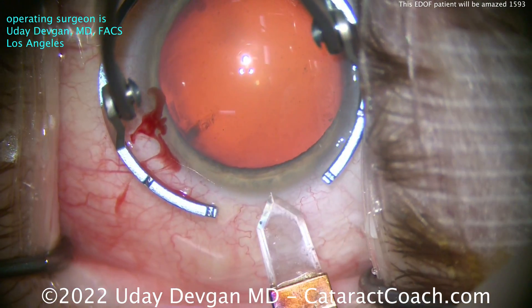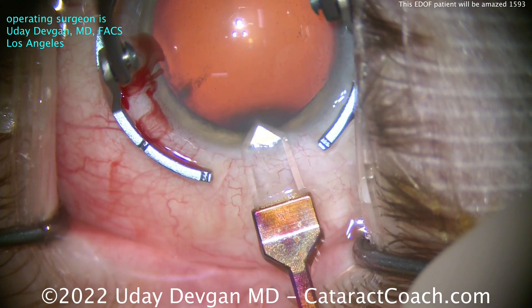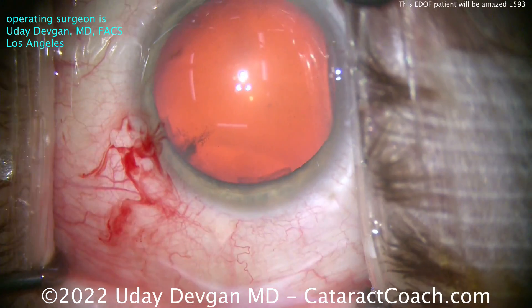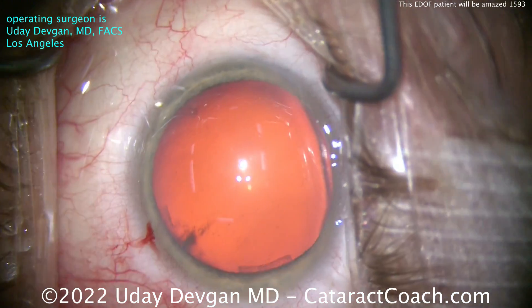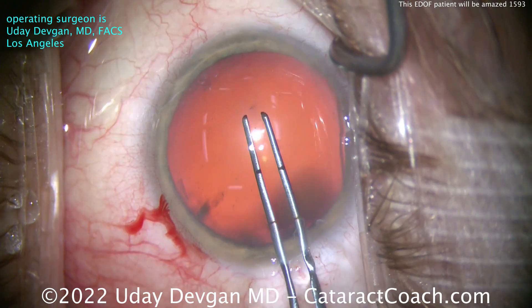In this case, with realistic expectations, we are aiming to leave this patient a pinch of myopia post-op — about minus a quarter, maybe minus a half even. I think the patient will be thrilled. The patient already walks around slightly under-corrected in both contacts and glasses.